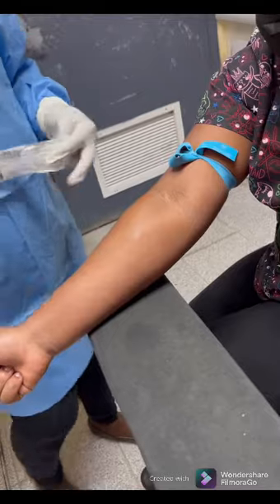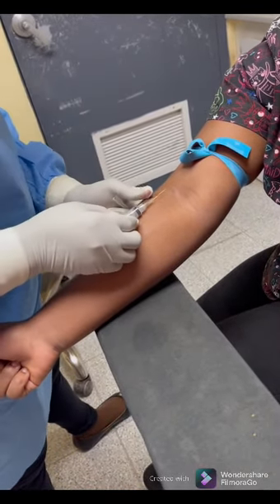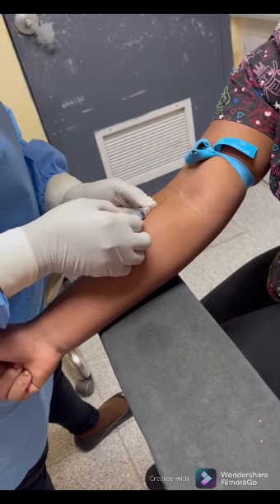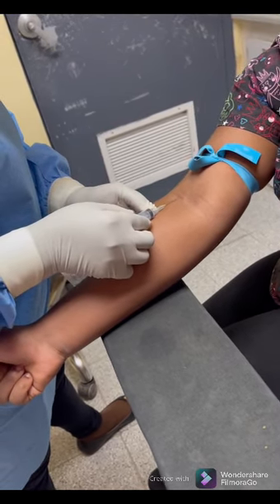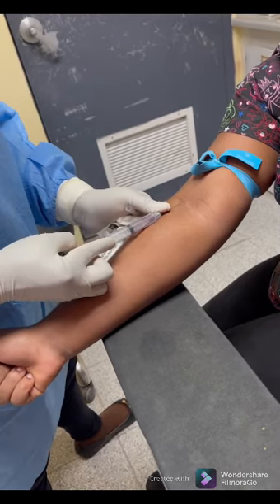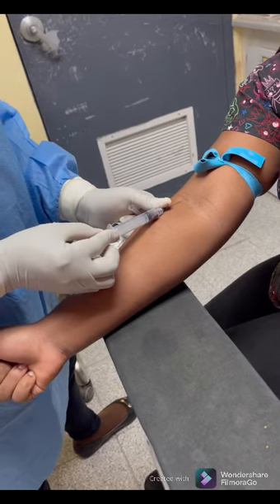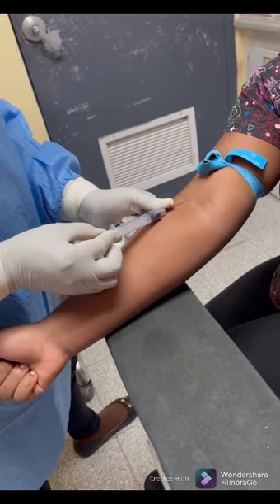Prepare equipment and put on gloves. Reapply the tourniquet, uncap and insert needle. Ask patient to make a fist, anchor the vein and insert the needle. Establish blood flow, release tourniquet, and ask patient to open fist.